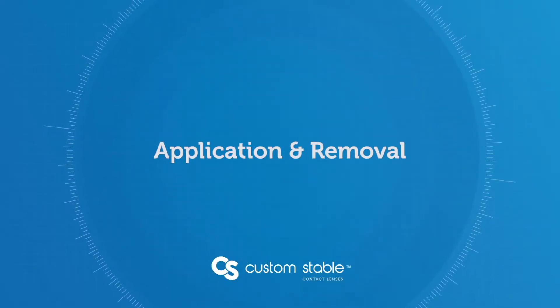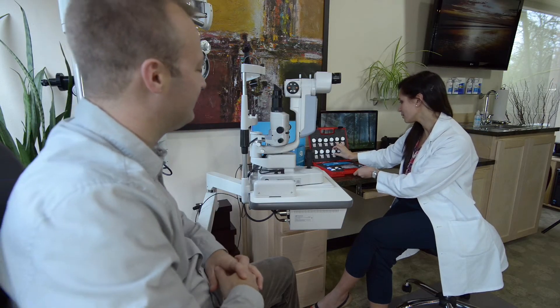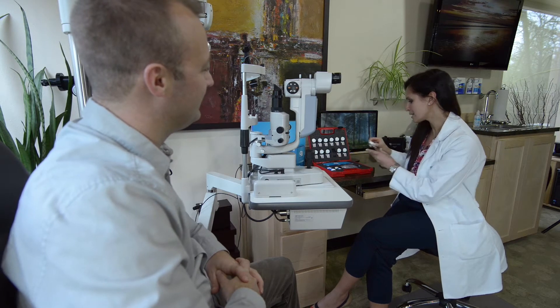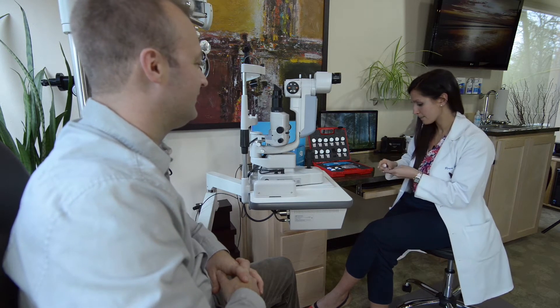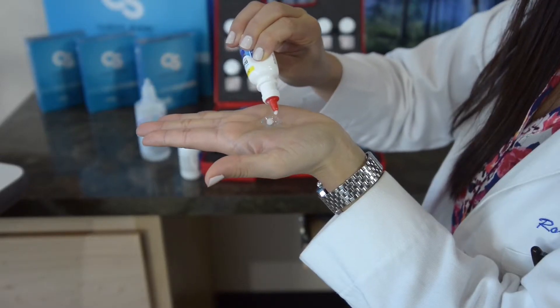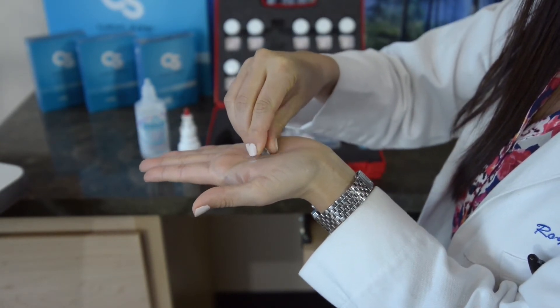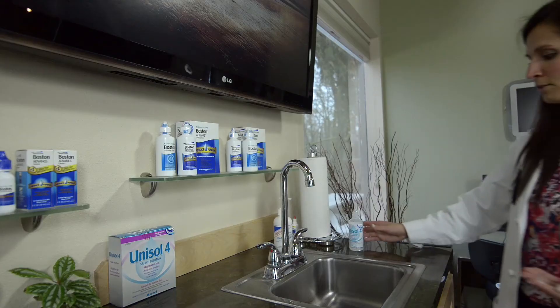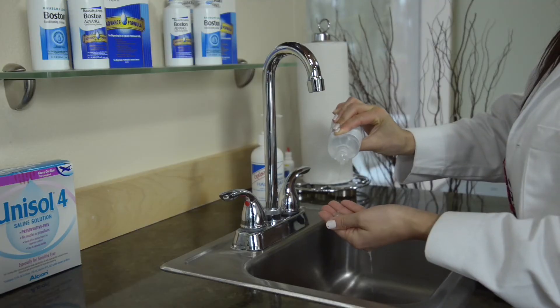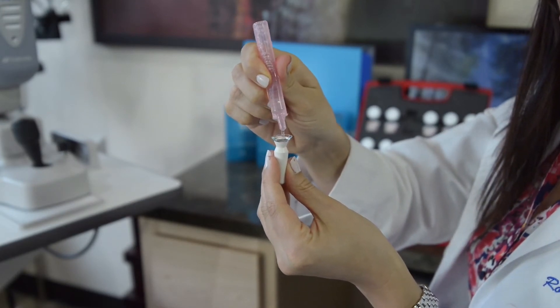Before we look at fitting methods, let's go over how to apply and remove the Custom Stable lens. Applying the Custom Stable is a straightforward process — the first step is to ensure it's properly prepared. When stored dry, take time to prepare the lens surface. It's best to soak the lens prior to use. If that is not practical, clean the lens for one minute focusing on the front surface, then rinse all solution off the back surface with preservative-free saline. Now fill the lens with preservative-free saline.